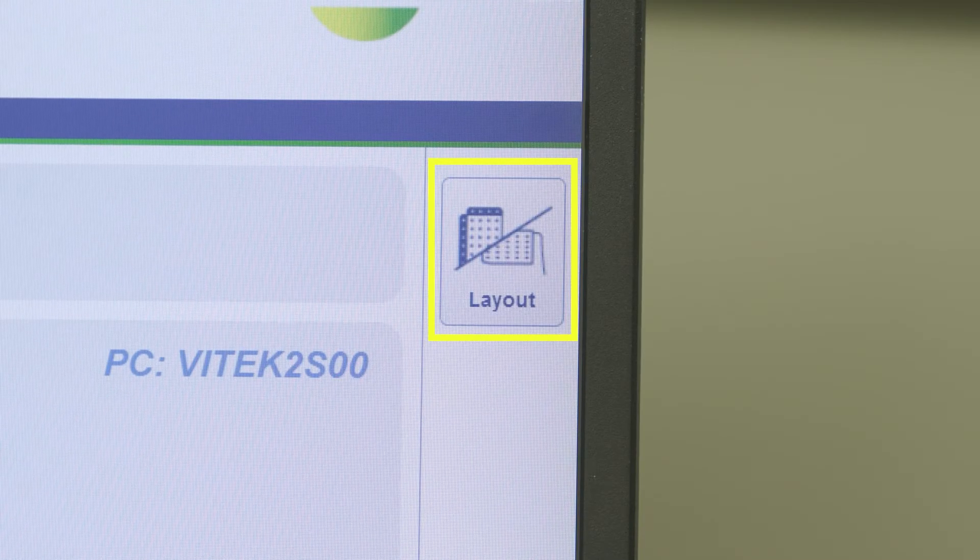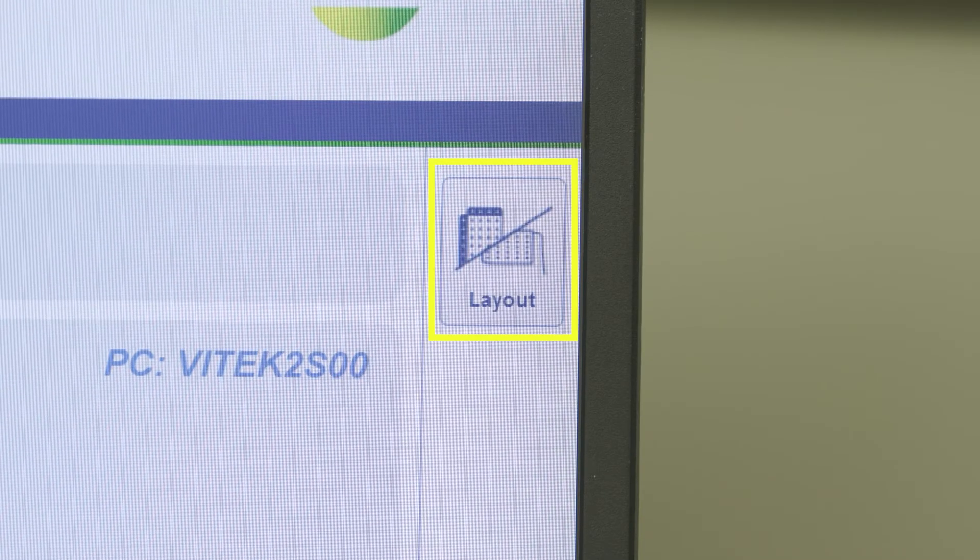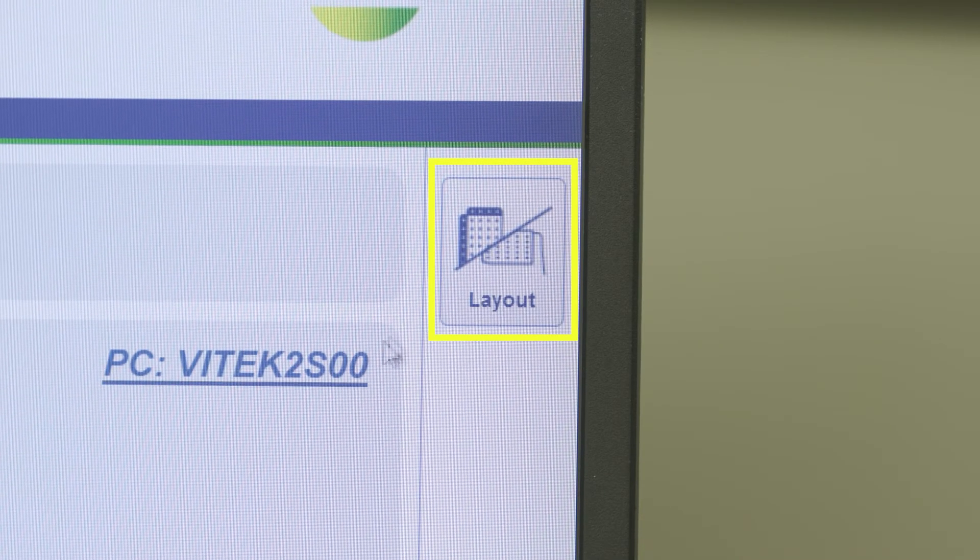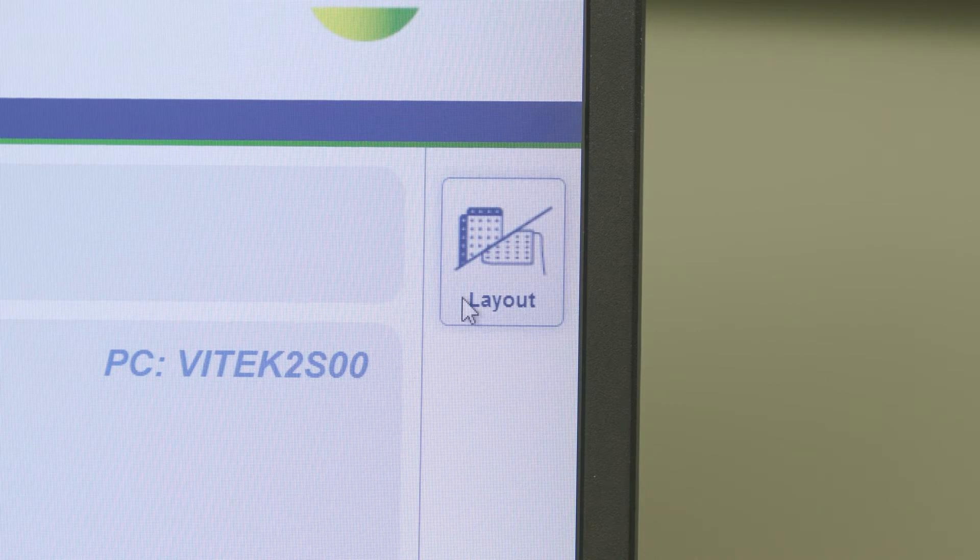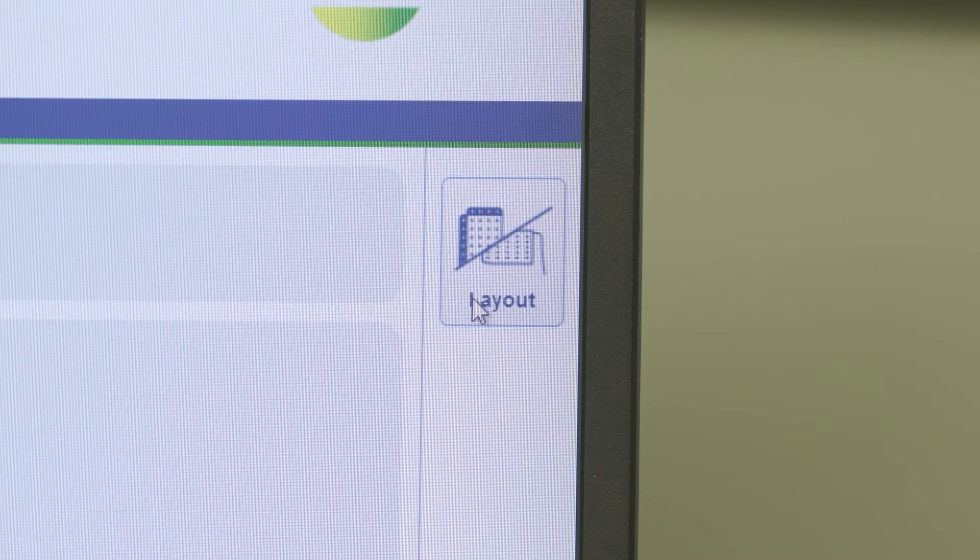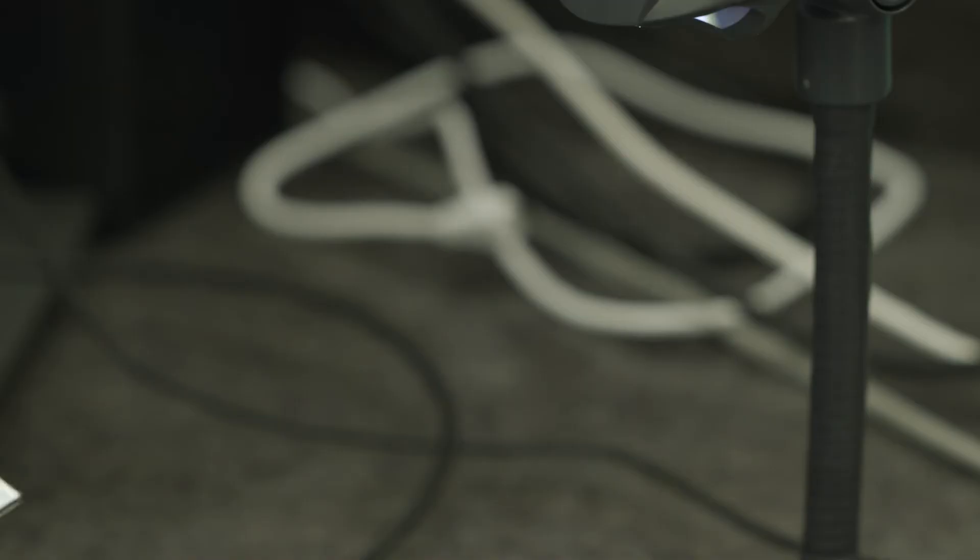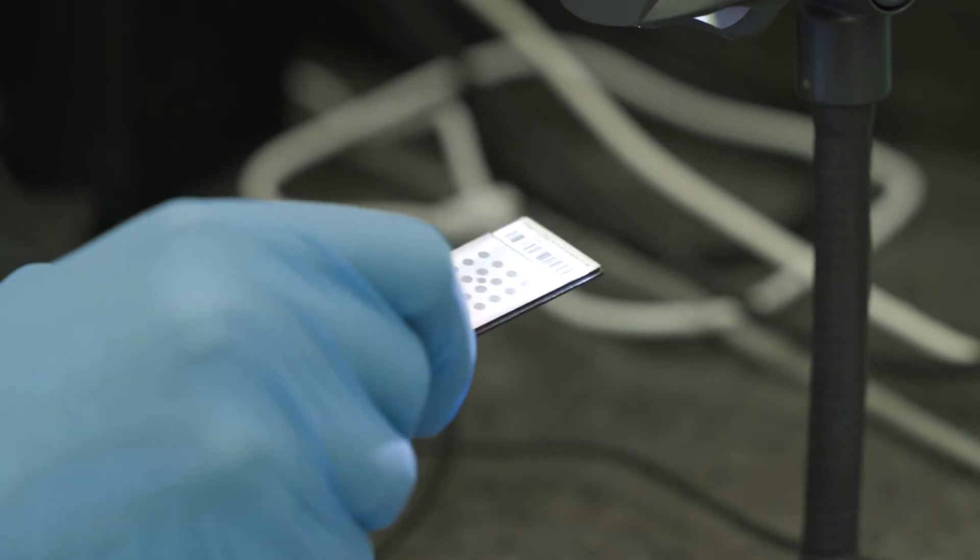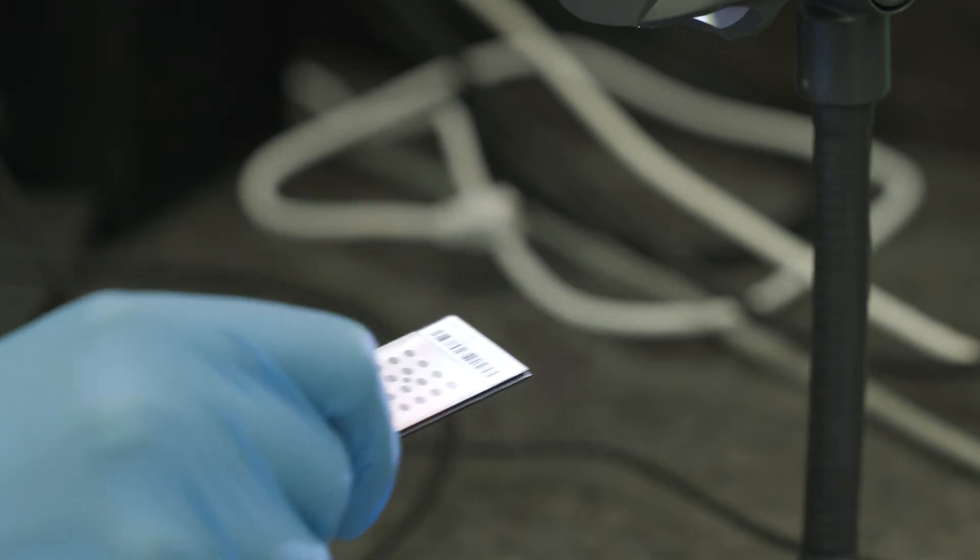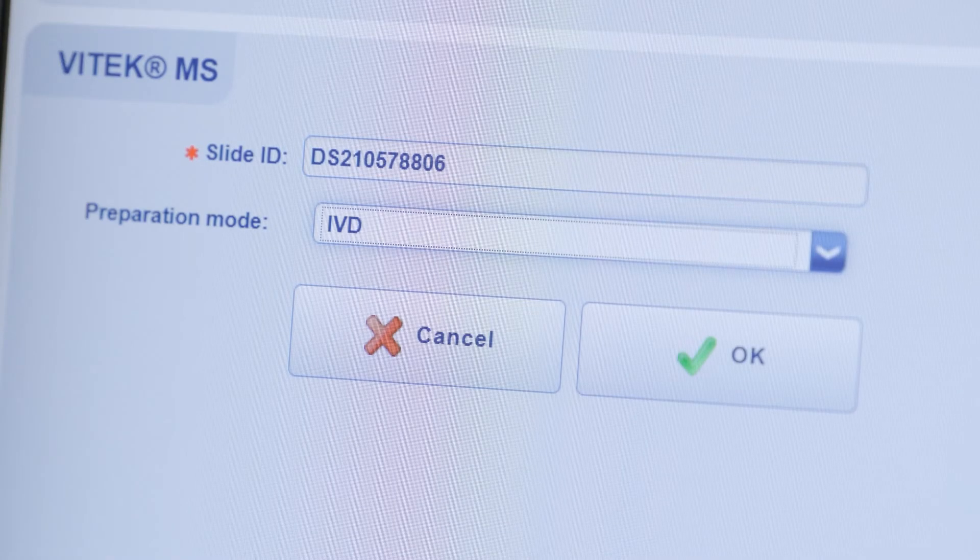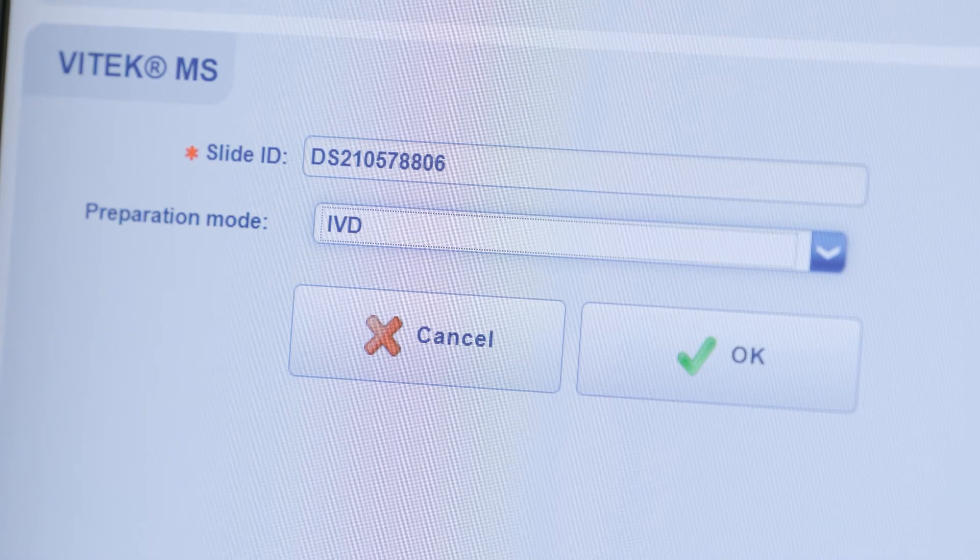From the sample preparation screen, click on the layout icon to display Vitec MS only. Note, this will be the only layout option available if no Vitec 2 instrument is connected. Scan the Vitec MS target slide ID with the barcode reader or enter it using the keyboard.